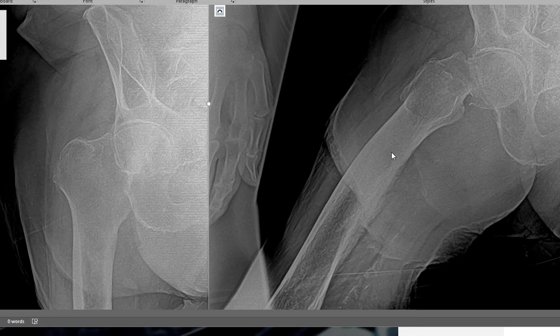And finally, I wanted to end with the fracture here. This is the one that we actually had tonight that Bill called about, and this is a hip fracture here, so it's kind of at the femoral neck. It's not quite a subcapital fracture, but it's a femoral neck fracture. But you can see the head of the femur is located in the acetabulum. So we have not dislocated our hip. So even though we broke our hip, so we broke the hip through the femoral neck, the femoral head is still located and we haven't dislocated our hip.